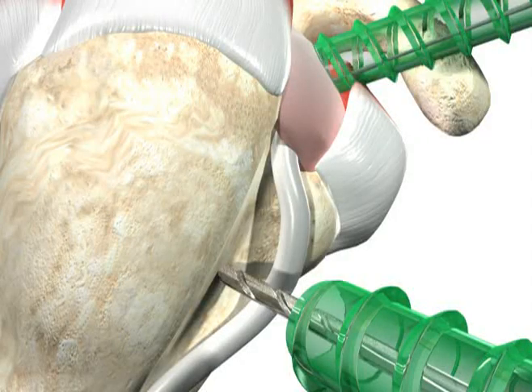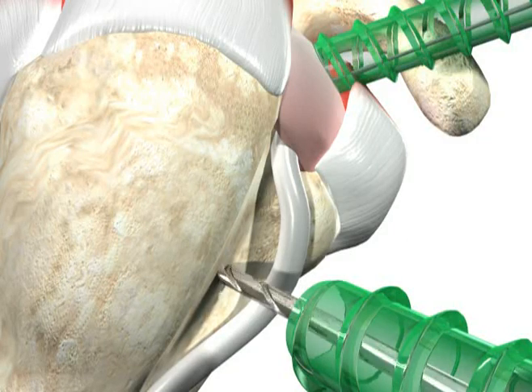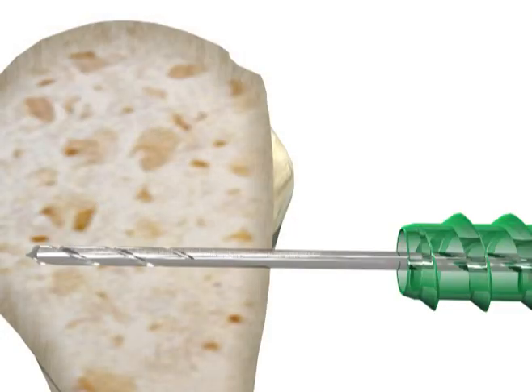Locate the desired position in the bicipital groove for reattaching the tendon. Drill the 2.4 millimeter guide wire perpendicularly to the humeral shaft in the desired location in the bicipital groove. The tendon fork can be used as a drill guide for placing the 2.4 millimeter drill pin.